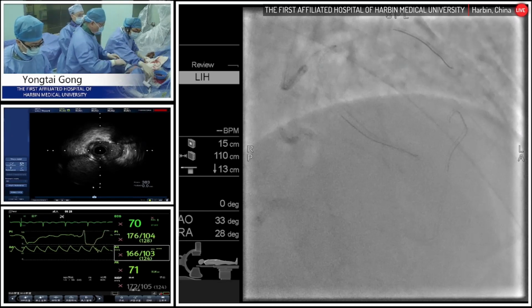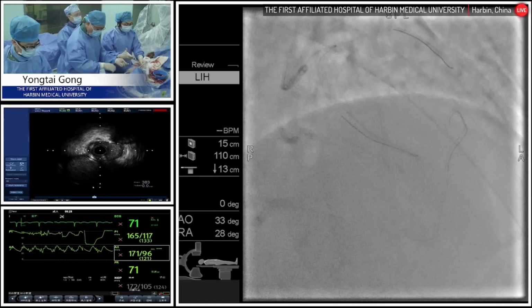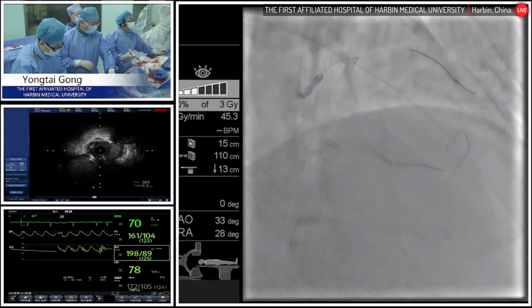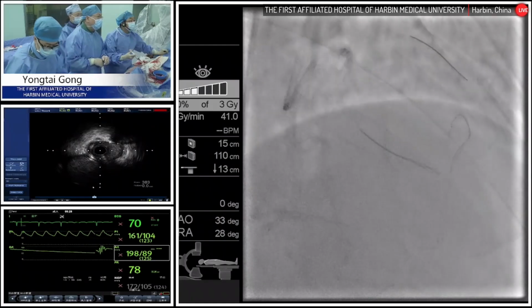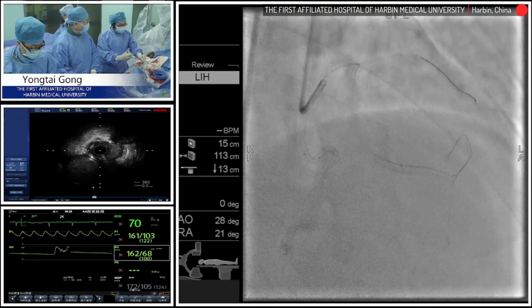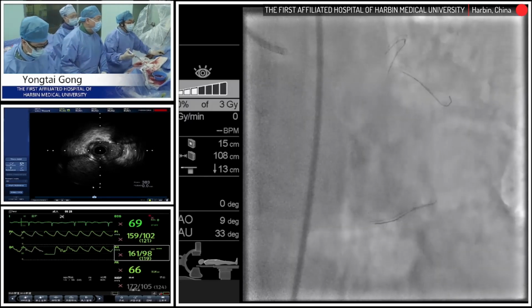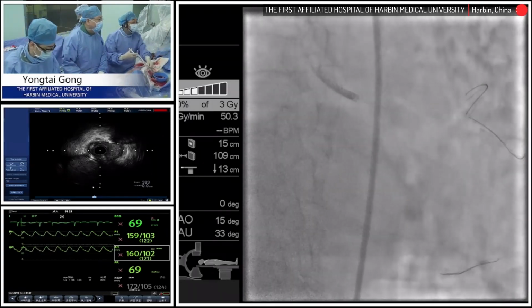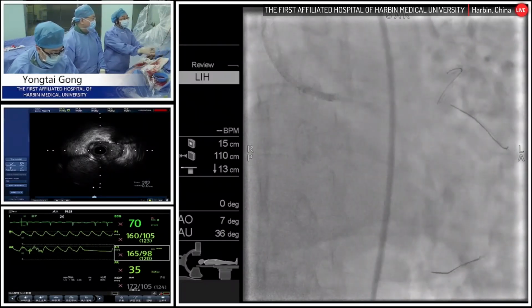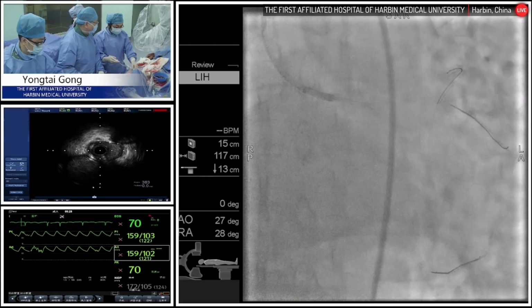And also for this patient, IVUS guidance is of key importance because, for this kind of patient, making sure the whole wire is in the true lumen is of key importance. And during our clinical usage, I think intravascular imaging is well applied. Several indications can be implied for IVUS imaging in CTO lesions. One thing I think is the most popular usage of intravascular imaging is to identify and have a good location to realize where the wire is.